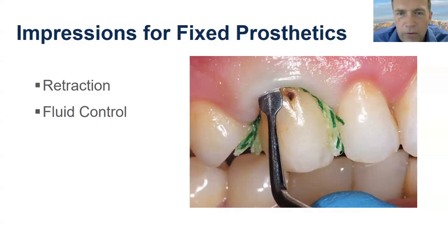I like to use a lower tray for the final impression on upper. Also, it's shaped like a custom tray. It saves a ton of material on the palatal. I've seen that done quite a bit, and I think it's a good trick. The only thing I'm concerned about is sometimes it depends on the tray. Some lower trays have kind of a little wing on the lingual side that's designed to pick up the mylohyoid ridge, and those can interfere with seating on the palate. So if you trim them off, it's fine. If you have one that's a little more symmetric, then that could work well.